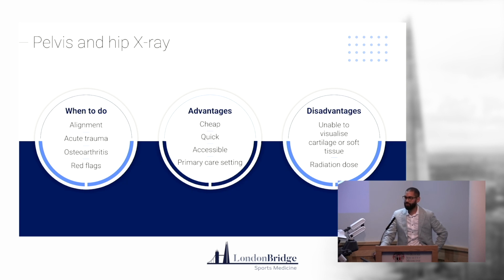Normally can get things done the same day. Getting the report back can be challenging, but often, at least they'll have the investigation done. Like we said, unable to visualize soft tissue or cartilage in the X-ray, but then that may not be necessary. Just think about the radiation dose, particularly in your younger patients. Very delicate area, very sensitive area, particularly in anyone in their teens and 20s. That's men and women. So just be careful about who you're requesting X-rays for and make sure there's a good clinical indication to do so.